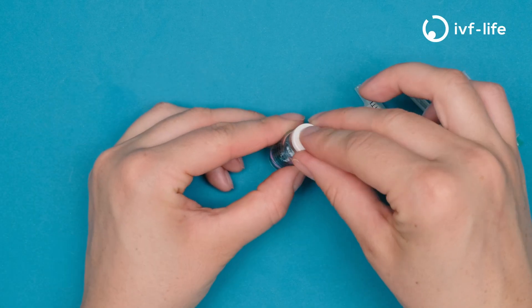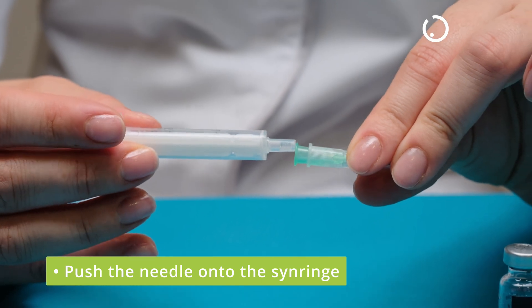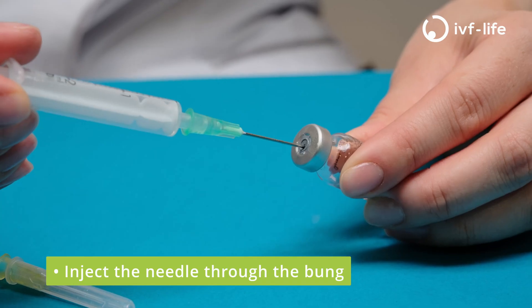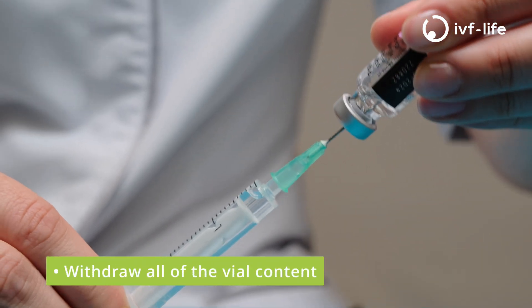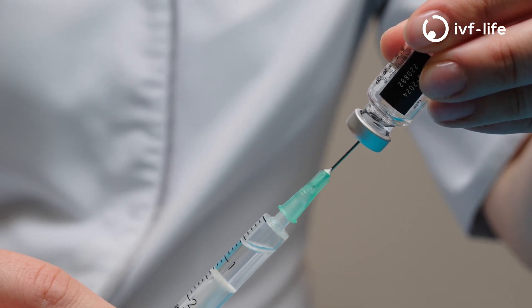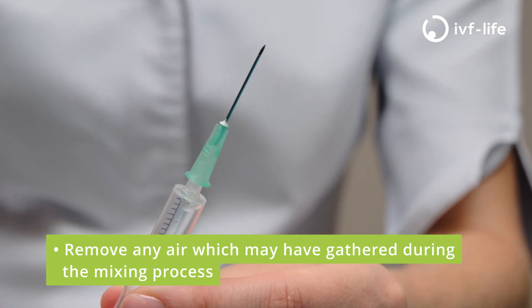Remove the protective cap from the vial. Take your syringe and locate the larger needle. Push on and remove the protective cap. We push the end of the needle into the grey protective part of the vial and withdraw all of the contents of the vial. Be sure to remove any air that may have gathered before injecting.